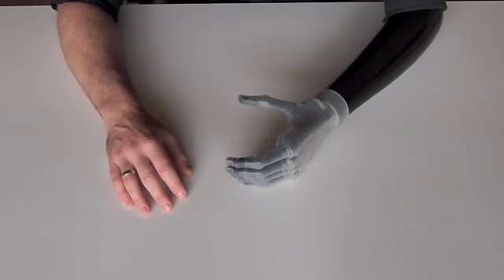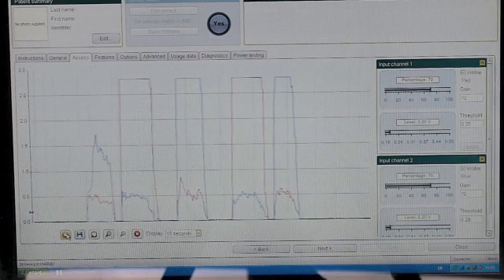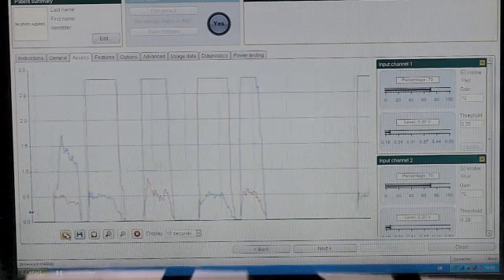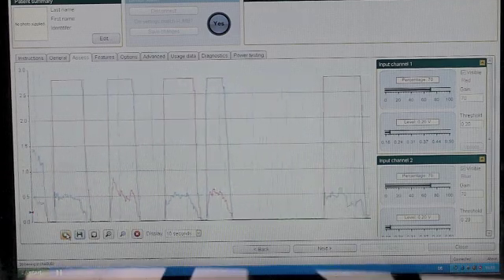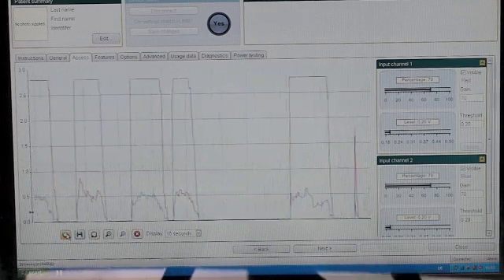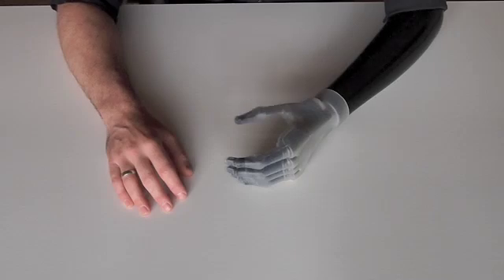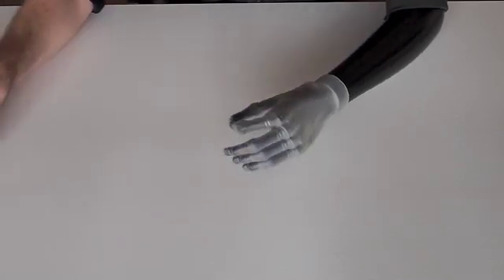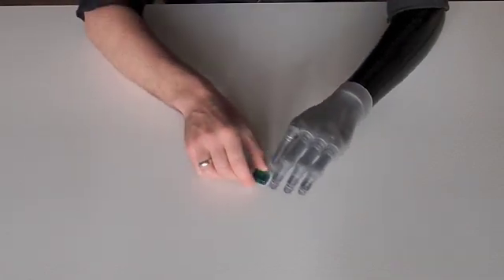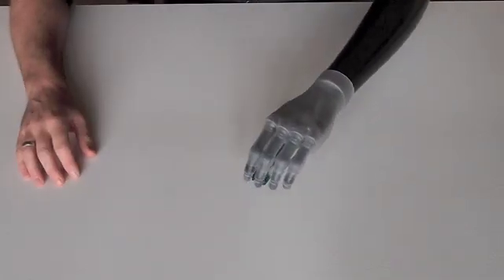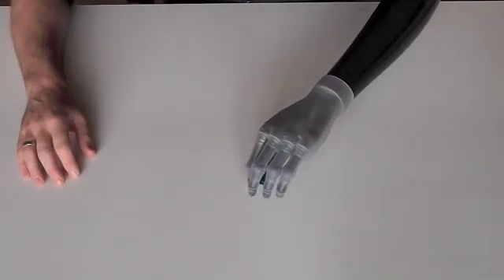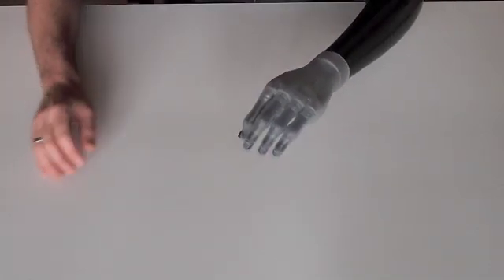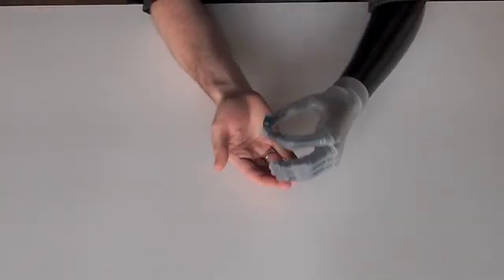I activate my second grip mode by sending two quick impulses to the opening electrode. My second grip mode is called precision pinch. It moves the index finger in opposition to the thumb. It's very useful for picking up small objects like this.